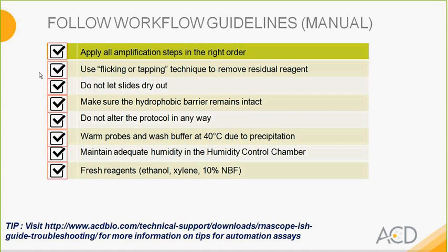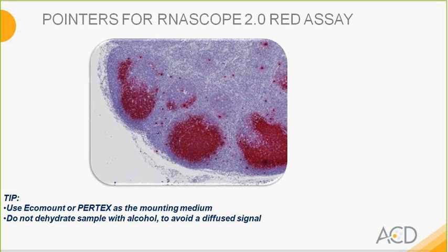We recommend that you use fresh reagents, and some of these reagents that are used routinely include ethanol, xylene, and neutral buffered formalin. We will now review pointers for each assay.